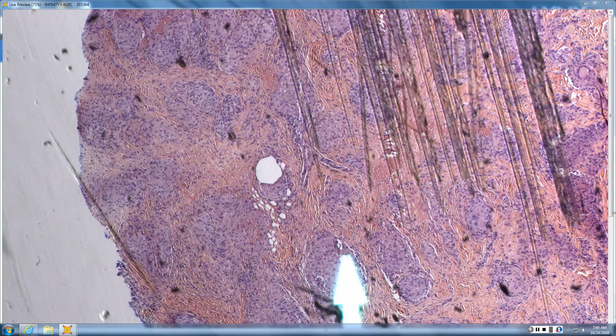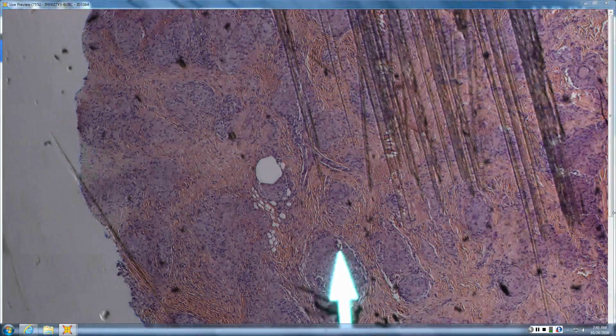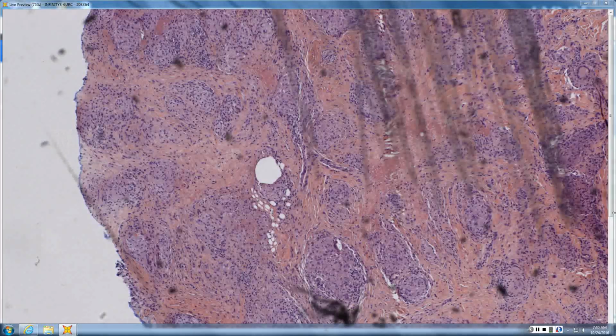There's something in there. Actually, I think you can start to see it. Right there, see that little bright fragment there? So you have silica in here, so what does that mean? That's from the foreign body, silica. But you also can still have sarcoid. Can't rule it out. Exactly, it's still sarcoid.